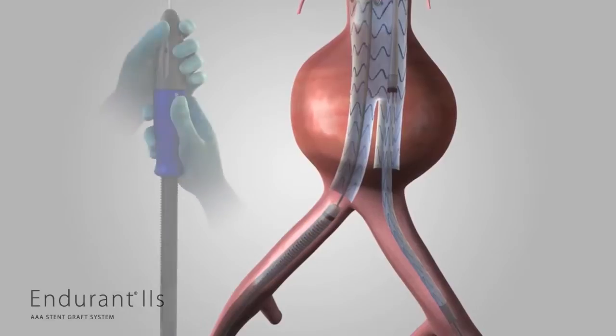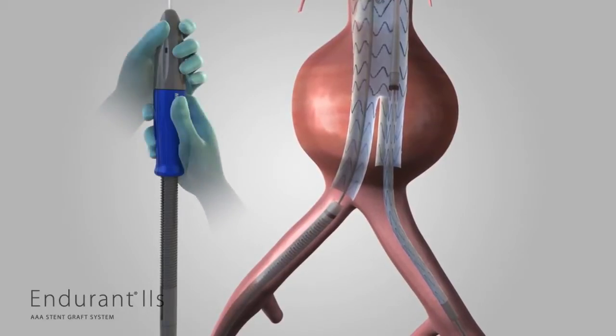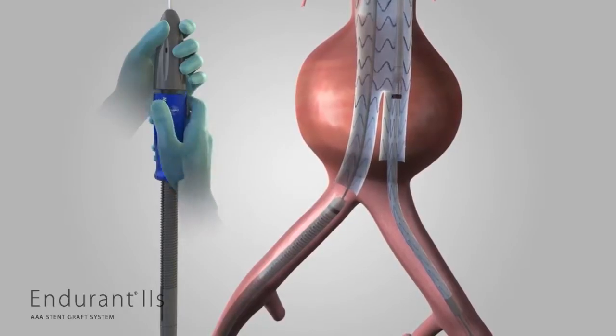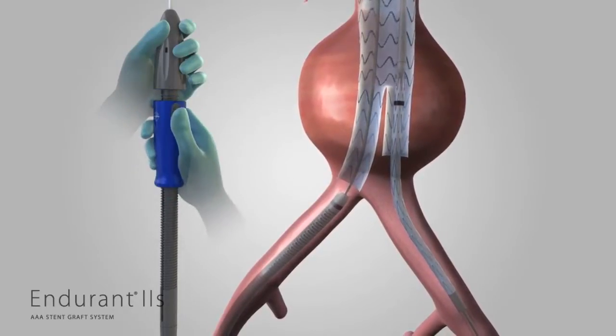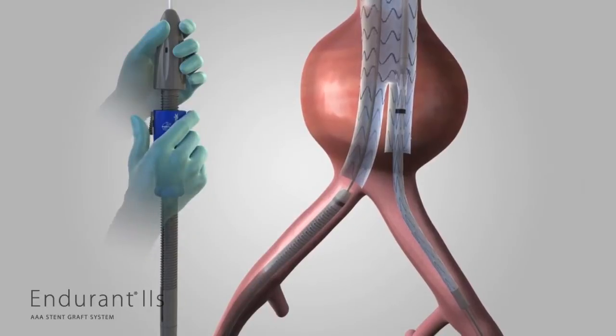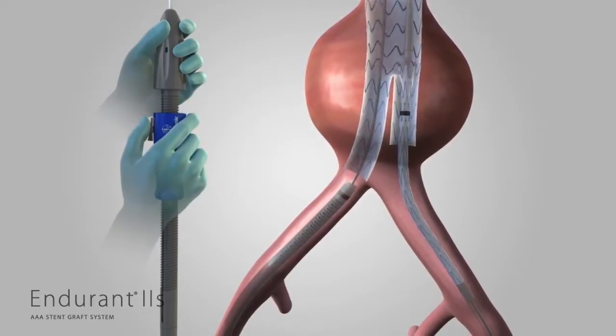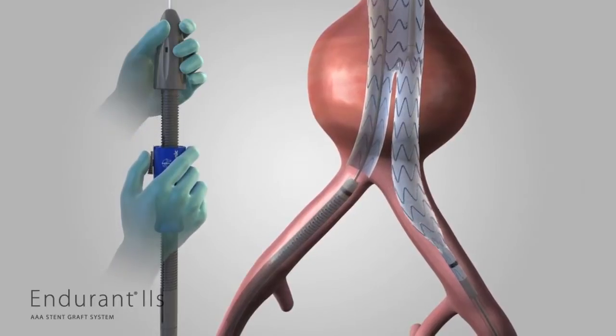Hold the front grip of the delivery system stationary. Then, slowly withdraw the graft cover with the other hand by rotating the slider counterclockwise. At any point, use your thumb to pull the trigger on the slider and pull the slider back all the way to finish deploying the stent graft. Remove the iliac delivery system.